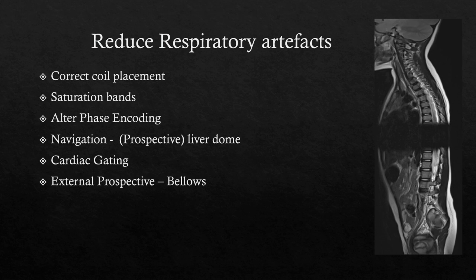New technology these days, the respiratory sensors are actually inbuilt into the scanner and can trigger automatically if it feels that that's what's required as you're scanning, which is fantastic for normal size adults whose chest lies in the exact right place when you're scanning.